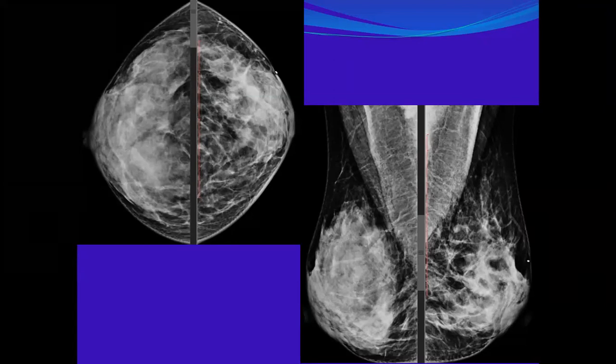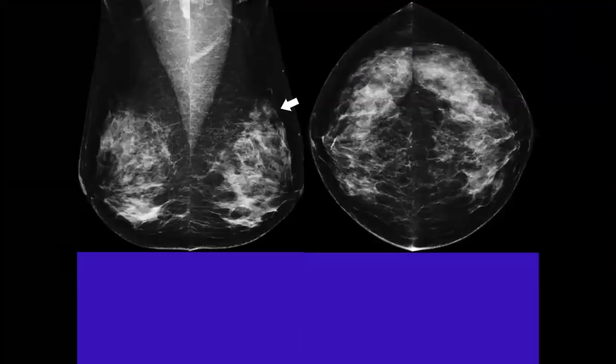Or maybe 2 if there is nothing, 3. And for screening, to be seen in the next screening, if it is screening. But if it is diagnostic, then I will look for any clinical abnormality. It will be alarming or worrying if it is associated with symptoms, especially a palpable abnormality. Yes. If a palpable abnormality, it will be worrying. I have to go further. Okay, thank you very much, Sarah. Well done. Okay. Thank you.